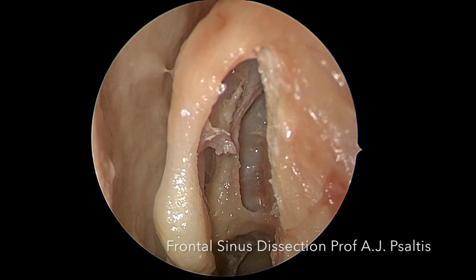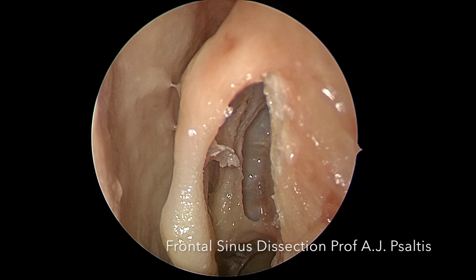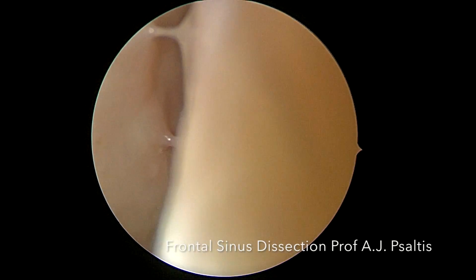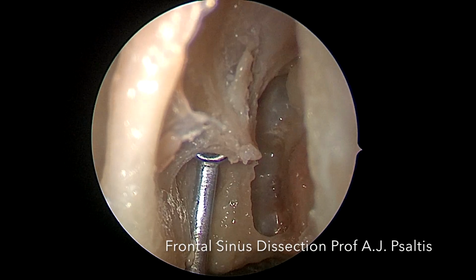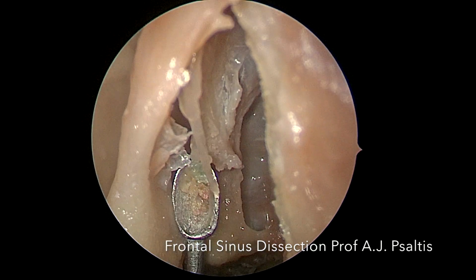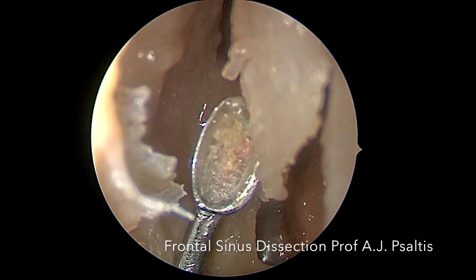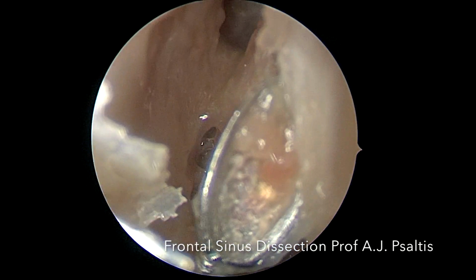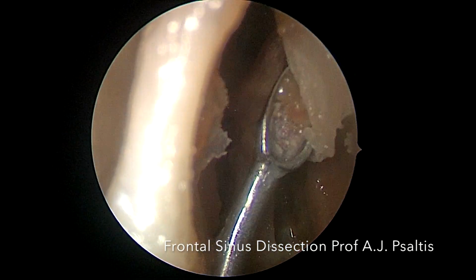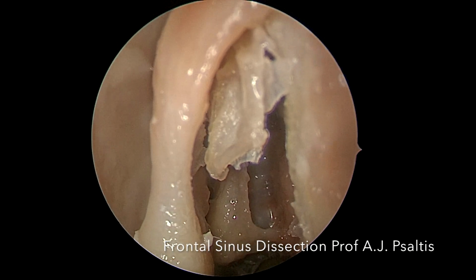Here we can see the posterior agger nasi, and we can also see a supra-agger cell located laterally. Medially, we follow the drainage pathway, fracturing the posterior wall of the agger nasi laterally. It is always better to fracture laterally to avoid injury to the skull base. What we can visualize here is that this patient also has an intersinus septal cell.